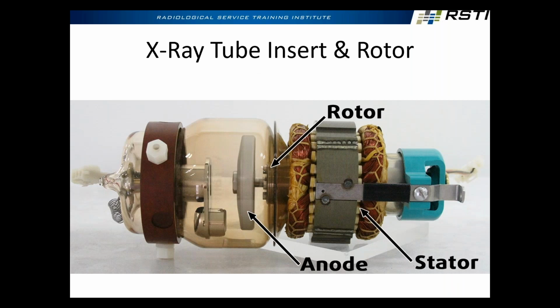So which one's more important to us? Bremsstrahlung or characteristic? Well, but here's the deal. Bottom line is, it depends on what we're trying to image. If all of my characteristic spikes all happen below or above the range that I need for a combination of penetration and absorption in my subject, then characteristic radiation doesn't help me at all.